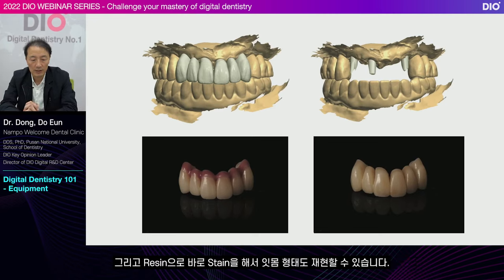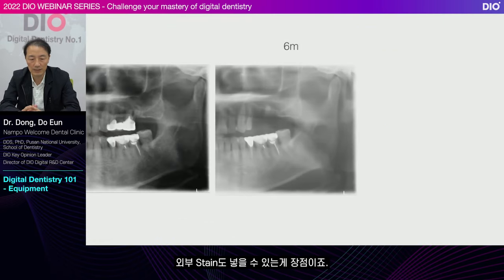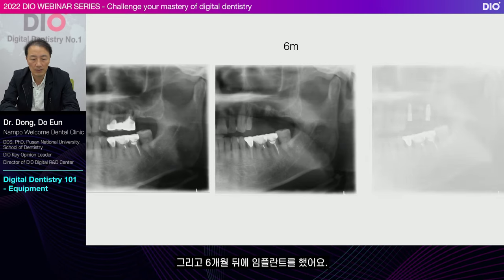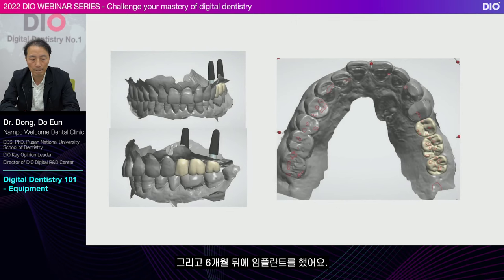You can also stain with the resin and reproduce the gum shape. You place the gum on top of what's printed. There's the advantage that you can add external stain. Let's look at this case. The model was made through extraction and preservation surgery for about 6 months. And 6 months later, the implant was placed and designed it.